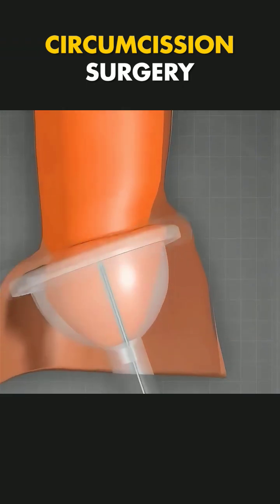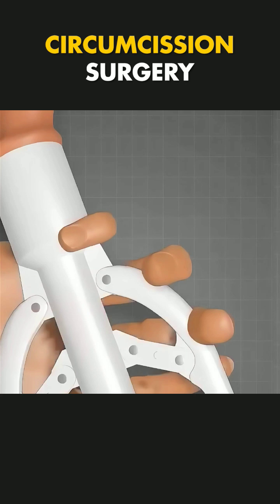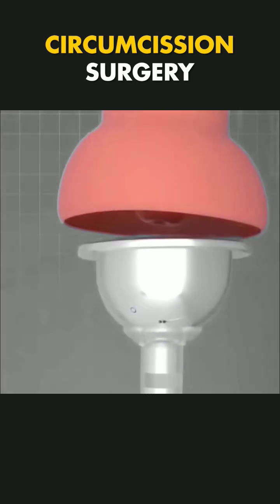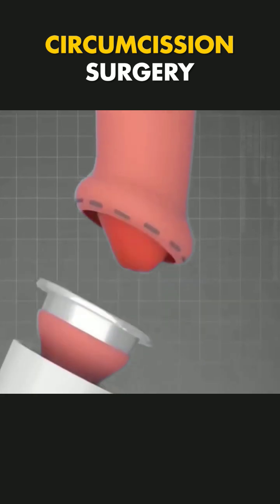ZSR circumcision surgery is an advanced technique for removing the foreskin using a specialized stapling device. It's designed to provide precision, reduce complications, and ensure faster recovery.